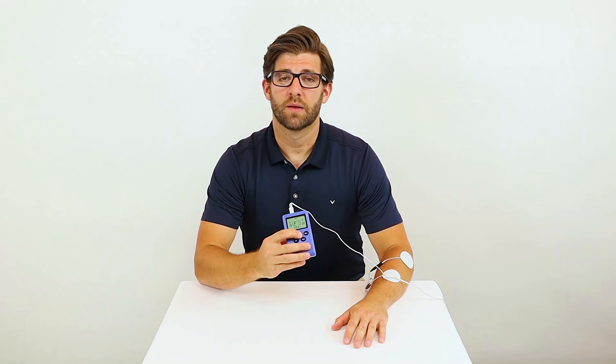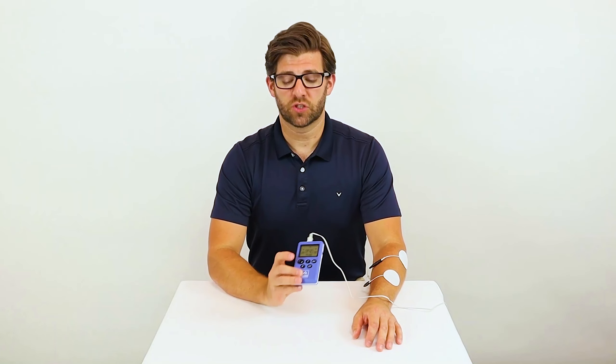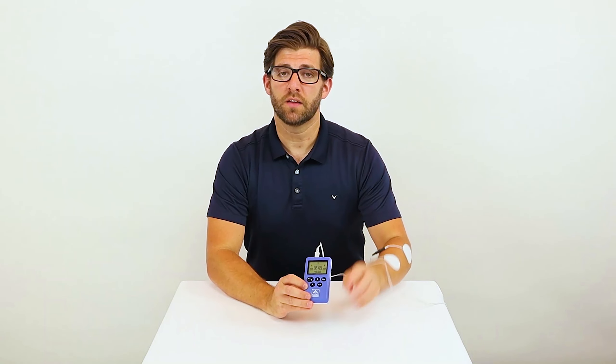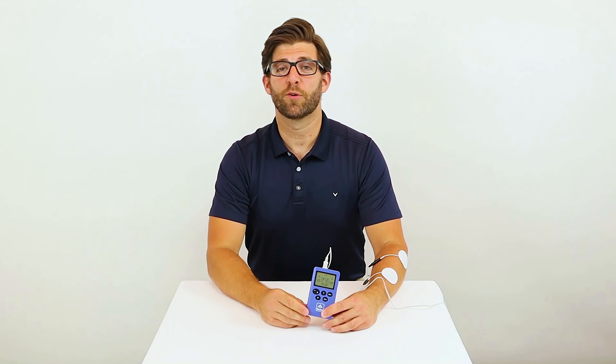Push it again, it comes back up. To use the pain protocols or the TENS, make sure that you select your channel by pushing the channel button until the letter is blinking. And then push the program button until it says P11, P12, or P13 for whatever parameters you would like to choose.